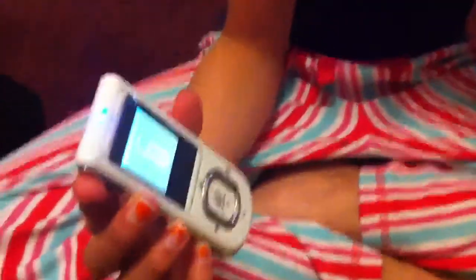My hearing aid. Okay, this is my remote. It turns up the volume or that kind of stuff, and it can change programs.